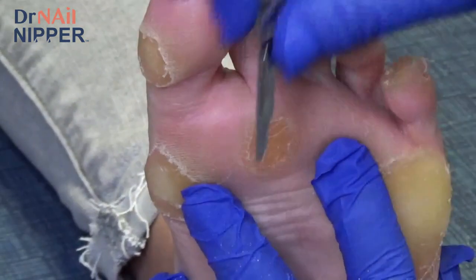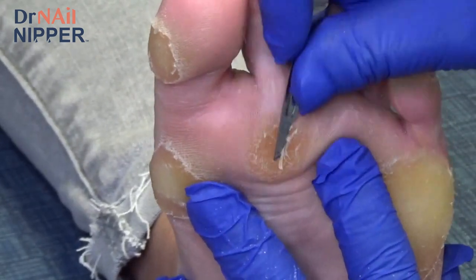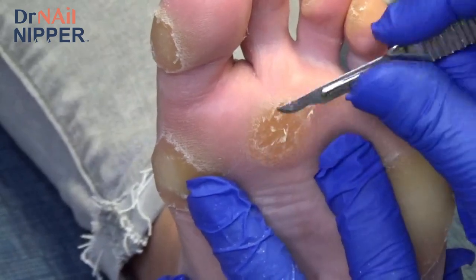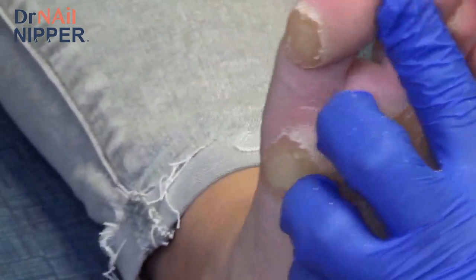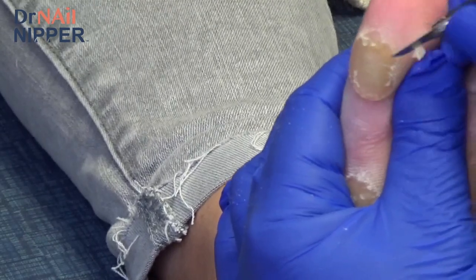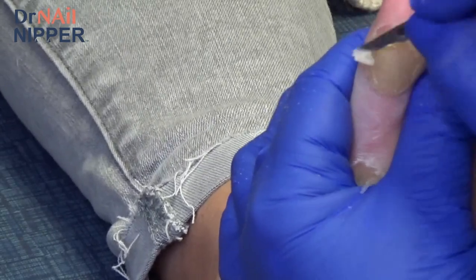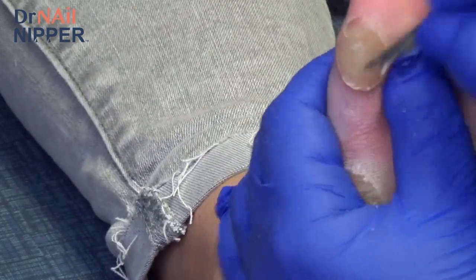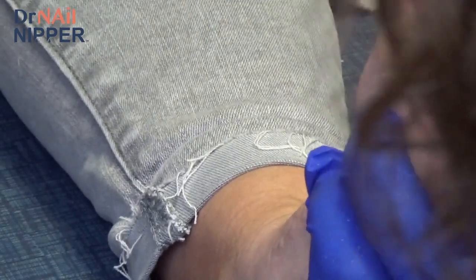So nice of you to let me do this video. I could probably make each foot into its own video. I think what I'm going to do, to get the heels, is put the back down and have you turn on your stomach. Yeah, that's what they used to do. See, all the great minds think alike.